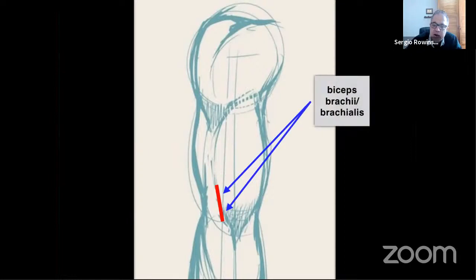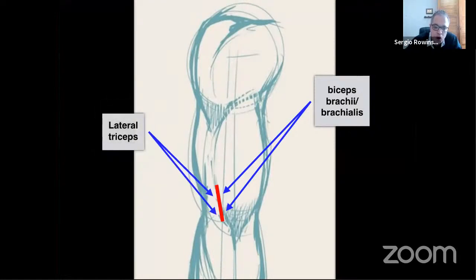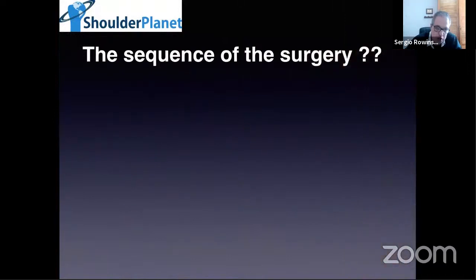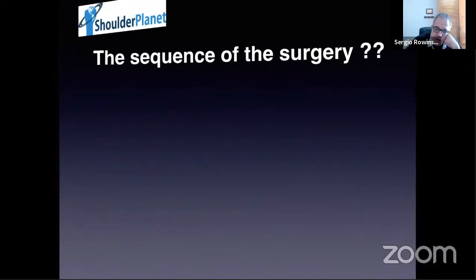So medially, the biceps brachii, the brachialis, and we have an anatomical interval here, and I always find the radial nerve as we are seeing here, and I'm going to talk about it. So the sequence of the surgery: I do both incisions in the way that I have said. This is the magic: constant traction, delicate. I always keep one person only for traction, a resident. You go very delicately.